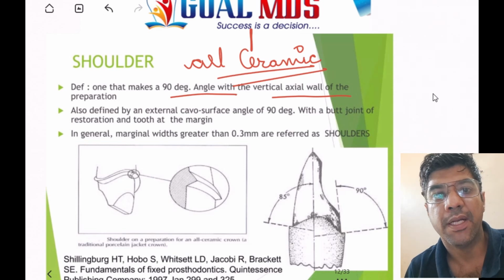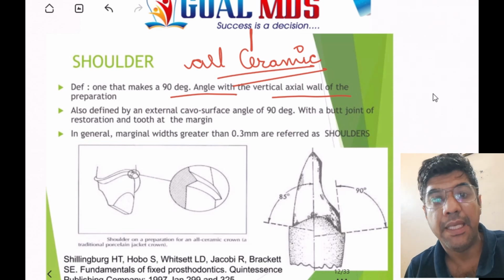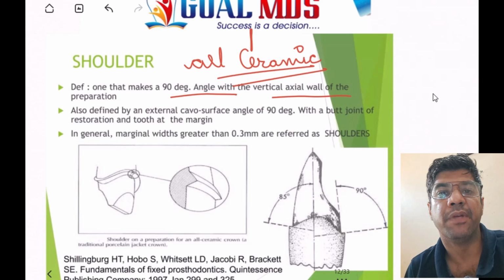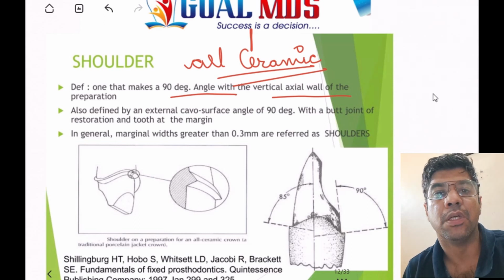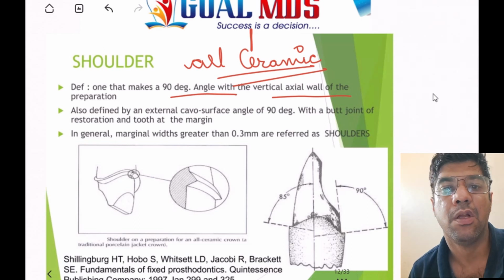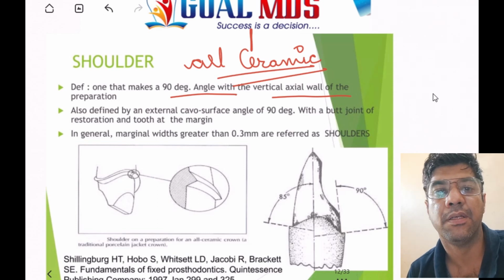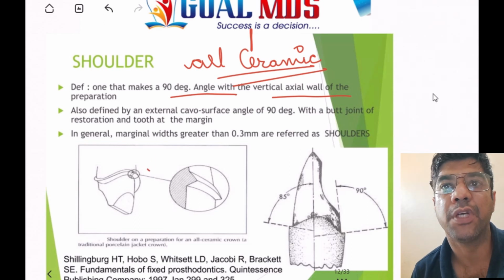So in the shoulder, the sharp right angle transection allows for a clean and aesthetically pleasing junction between the restoration and the natural tooth that contributes to a natural looking smile. So they are well suited for all ceramic restorations due to their structural benefit. Remember, the shoulder finish line is used in the anterior restorations.